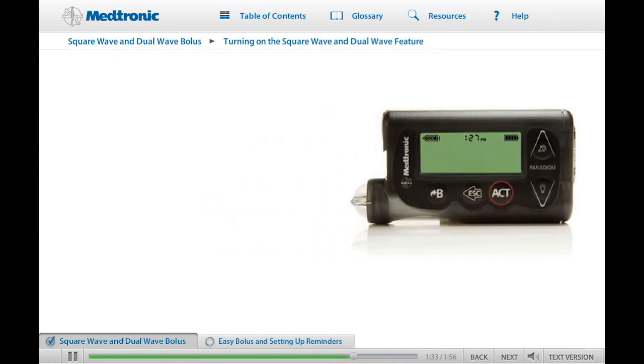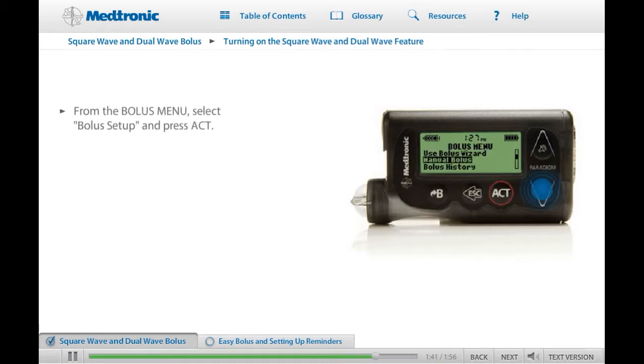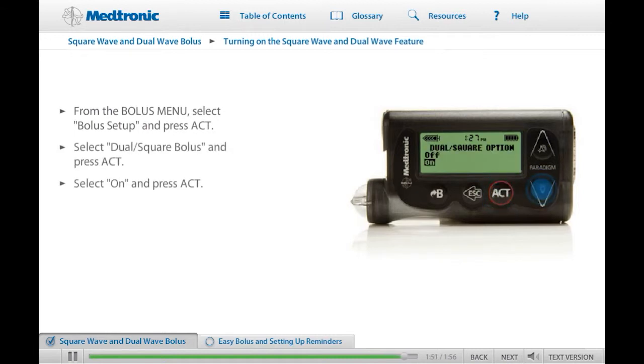If you want to practice using this feature, the first step is to turn on the dual wave square wave bolus option. In the Bolus menu, select Bolus Setup and press Act. Then scroll down the Bolus Setup menu to select Dual Square Bolus and press Act. Now select On and press Act again. The feature is now on.